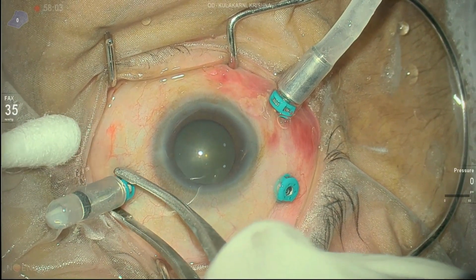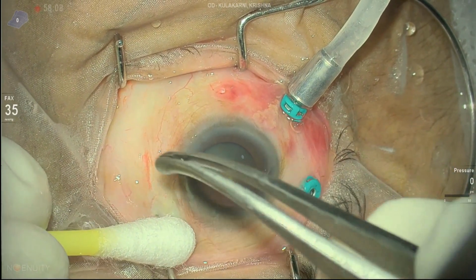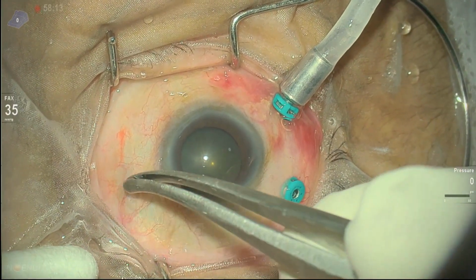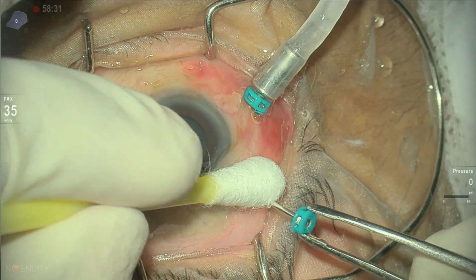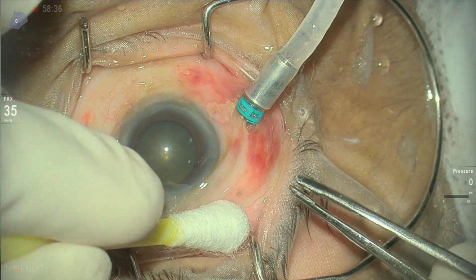After completing the fluid air exchange, silicone oil air exchange is done. First, the vent is removed once the silicone oil is almost filled, along with the port. After the globe is formed, once the silicone oil is completely filled, the silicone oil starts going inside the infusion cannula.